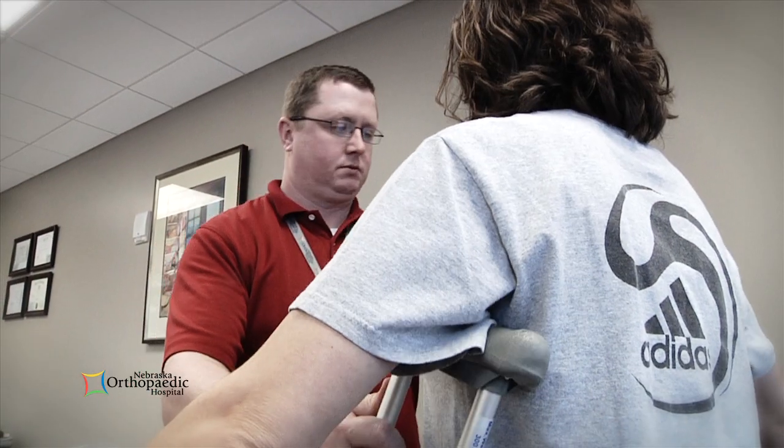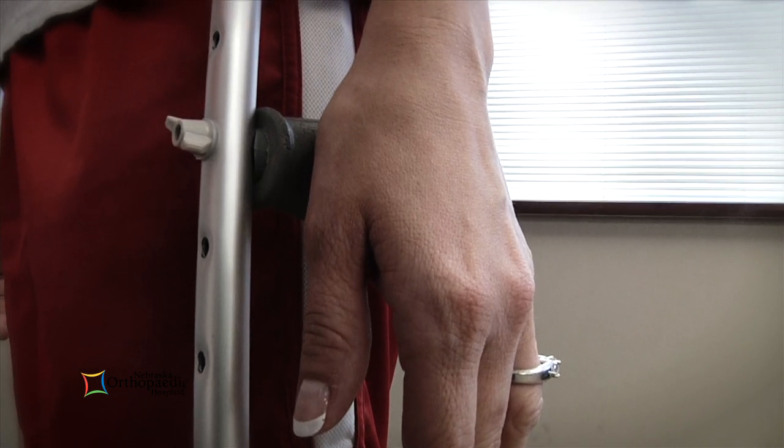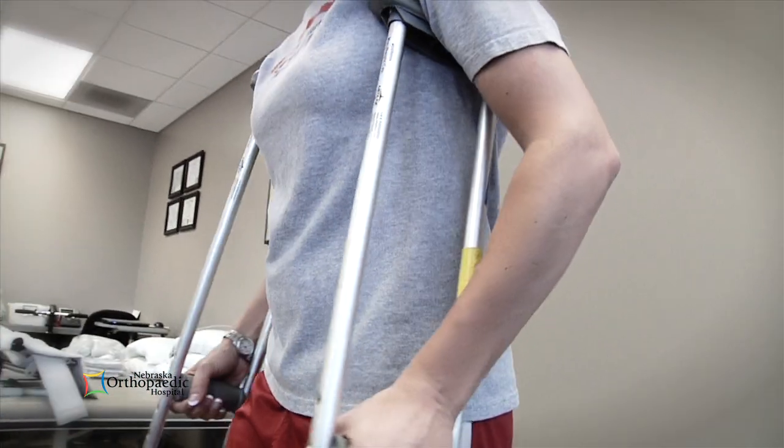When standing tall, there should be a two-finger gap between your armpit and the top of the crutches. Your wrists should be even with the hand grips when your arms hang at your sides. When using the crutches, your arms should be slightly bent at the elbows.